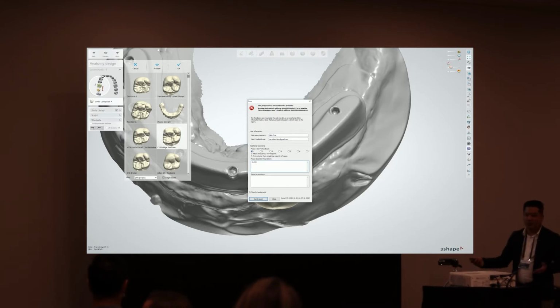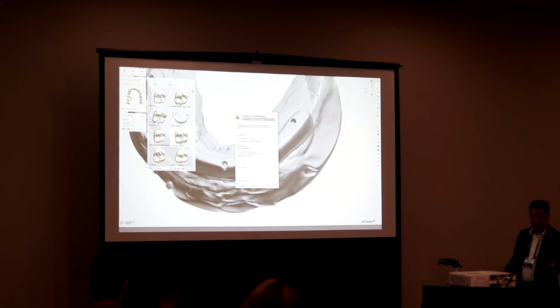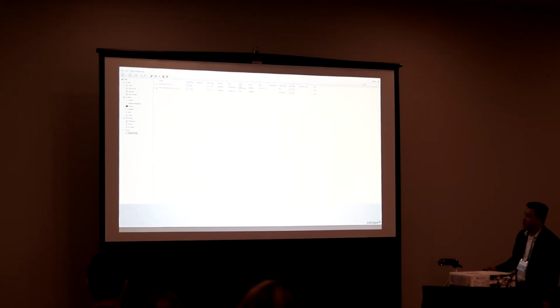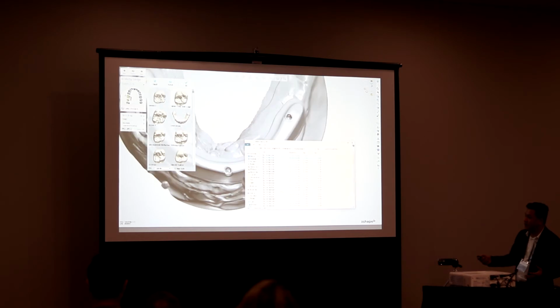Can anyone tell me what we did with the software to make it so angry? So again, going back to my analogy there, we need to supply some kind of information to the software that it's looking for, so it'll pass, right? So I said, oh, maybe it's corrupted. So we'll test it.